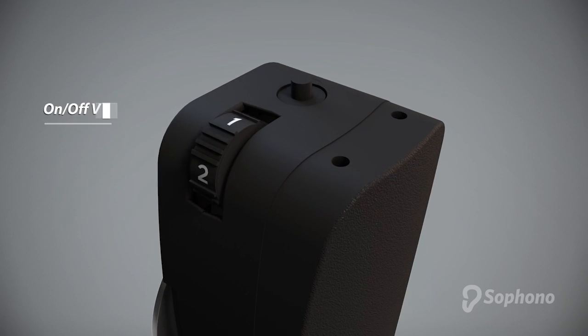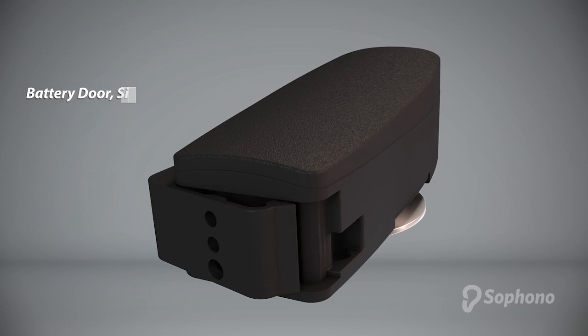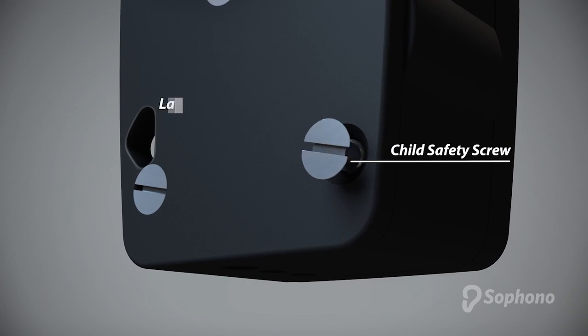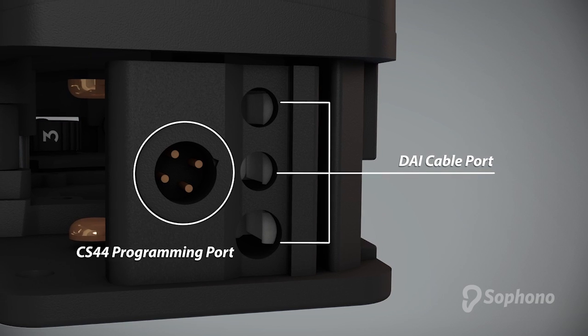The processor has a combined on-off and volume control, a programming button, dual microphones, a battery door for a size 13 battery, a child safety screw to secure the battery compartment, and a safety lanyard. There is also a DAI port and a programming port for a CS44 programming cable.